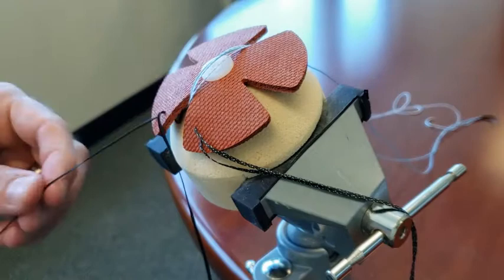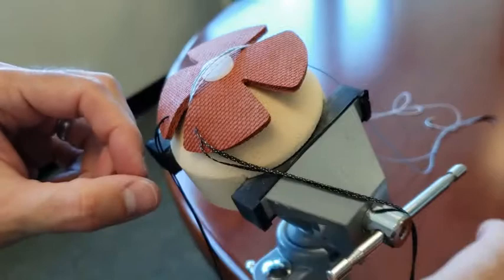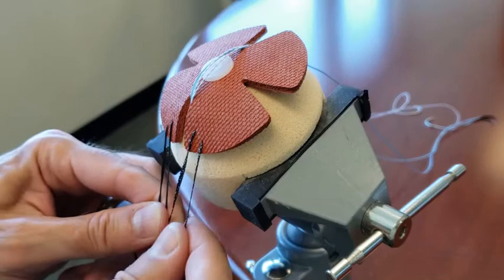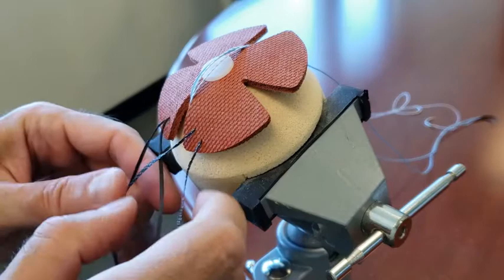Now this is a good opportunity to check where your limbs are located. You're going to grab one limb from one side and a limb from the other side and start crisscrossing. You can approximate these limbs down to where the distal anchors are eventually going to be, and once you do this you can pull the tendon down — you can see here that it lays down nicely.